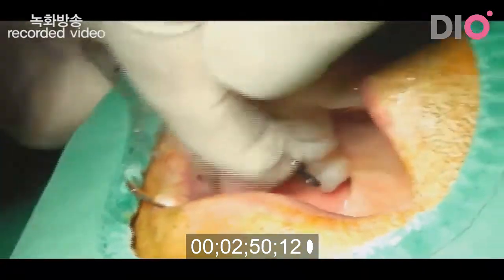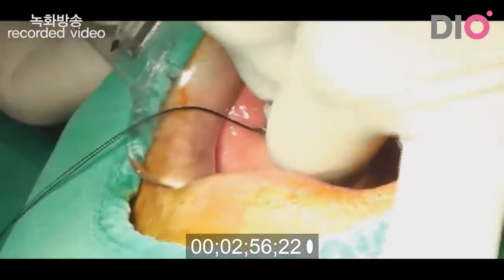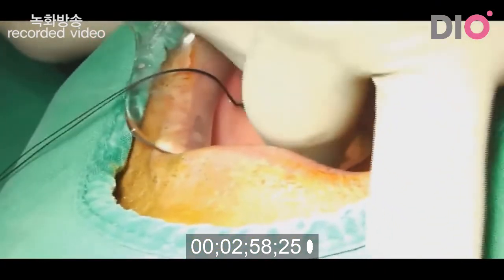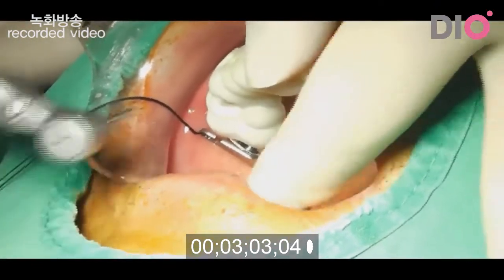And then I will drill in the second molar area. Okay, here. Okay, again 2.7 drill.